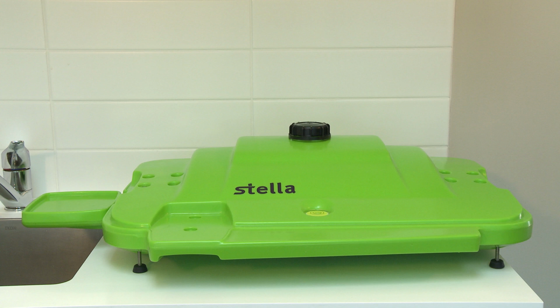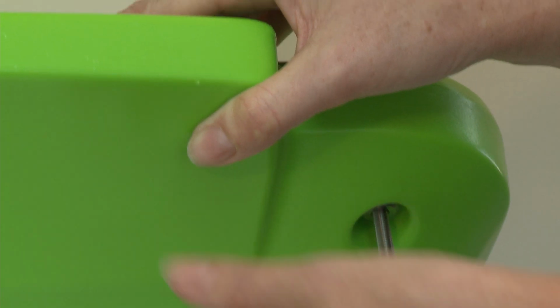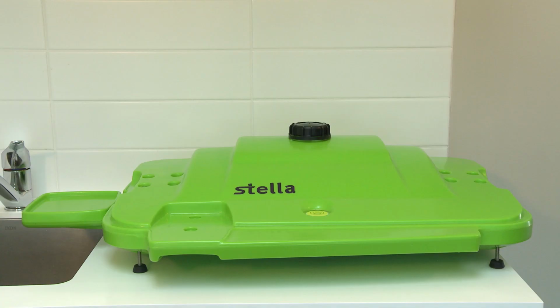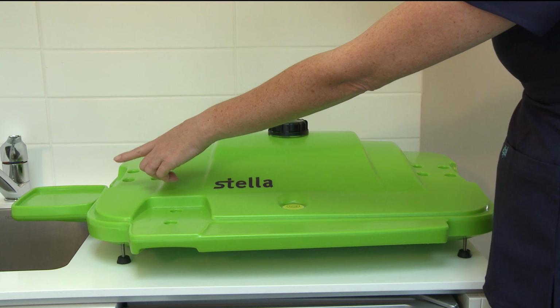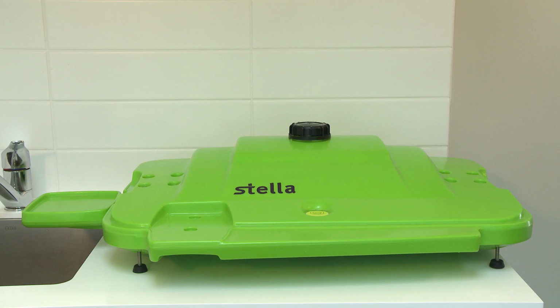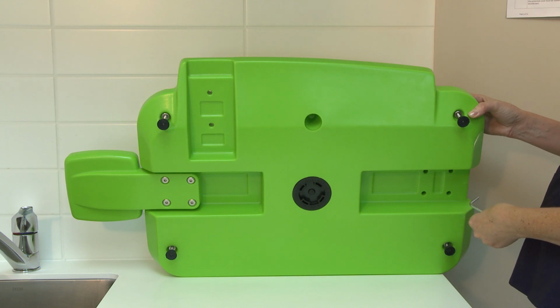Place Stella Cradle on the bench or trolley where the Stella disinfectant will be located and adjust the feet. Check the inbuilt spirit level to ensure the bubble is in the center, indicating that the cradle is level. The Stella Cradle has a shelf to house the pulse unit. The shelf can be located on either side of the main unit, depending on bench setup. An Allen key is used to remove and shift the tray to the other side of the cradle.